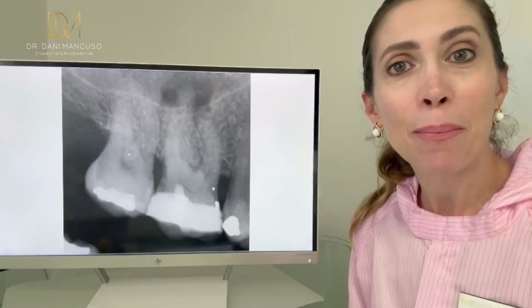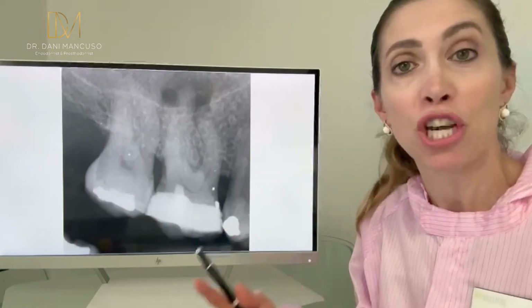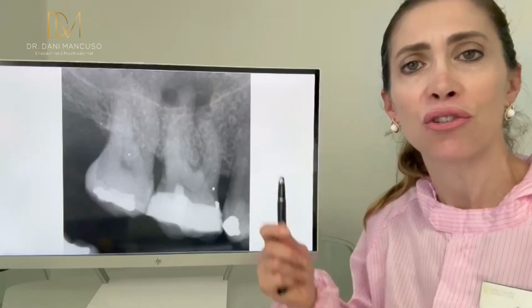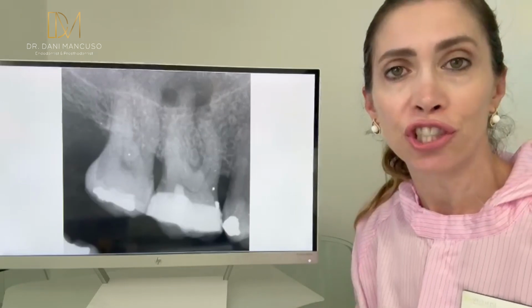Have you ever had problems finding the MB2, or when you can't find the pulp chamber because it's all calcified and you don't feel that fall? Yeah, there are some tips and tricks that I'm going to share with you.